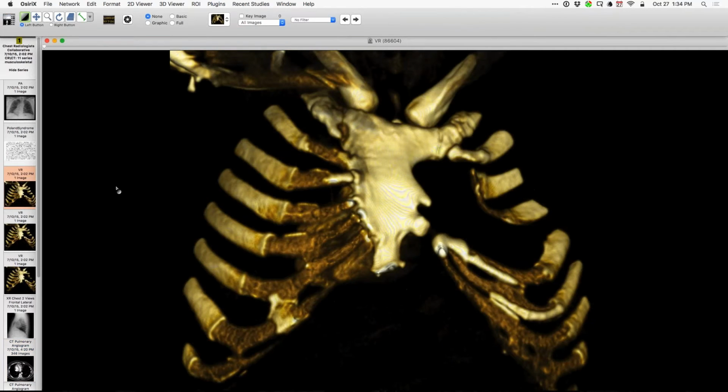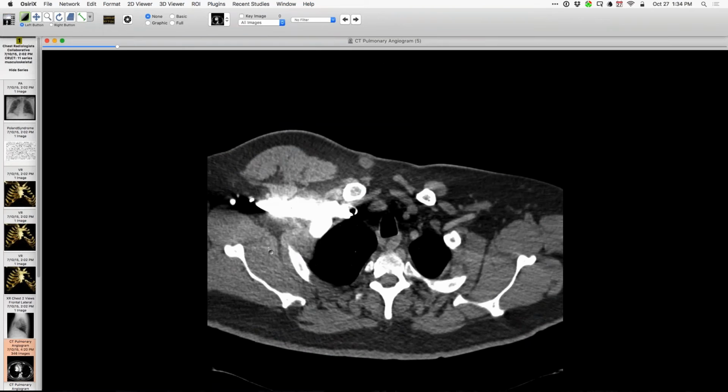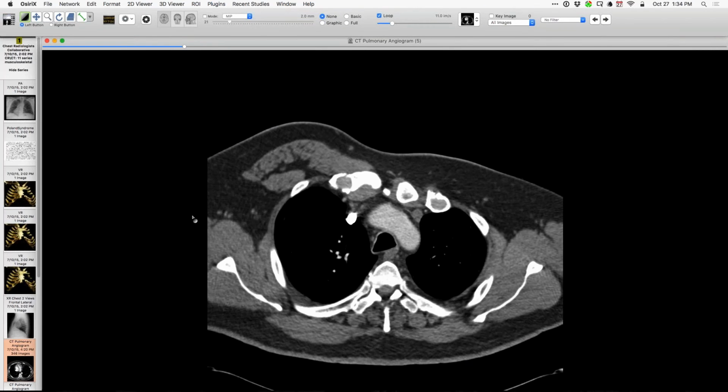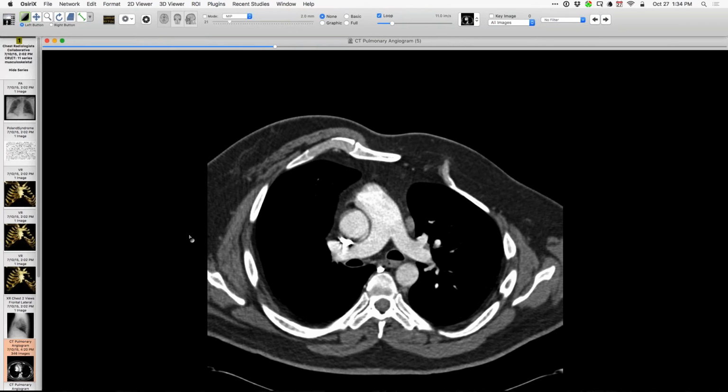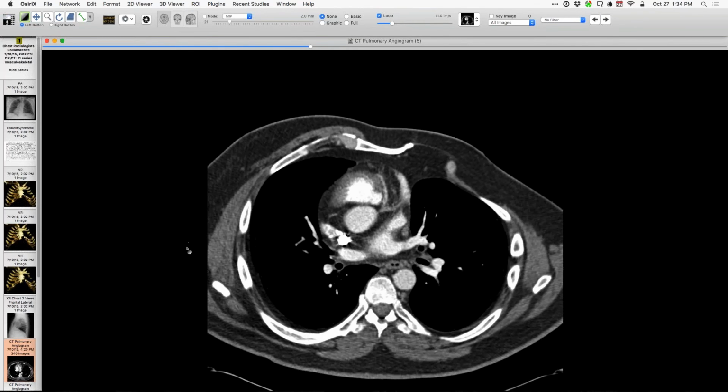So this is what a VRT would look like. That sometimes does occur along with the absence of the pectoralis muscles, absence of one or more costal cartilages on the affected side. And here's a nice example of that. And I presume that's a sebaceous cyst. So just a really nice case of Poland syndrome, which just happens to have a persistent left SVC.